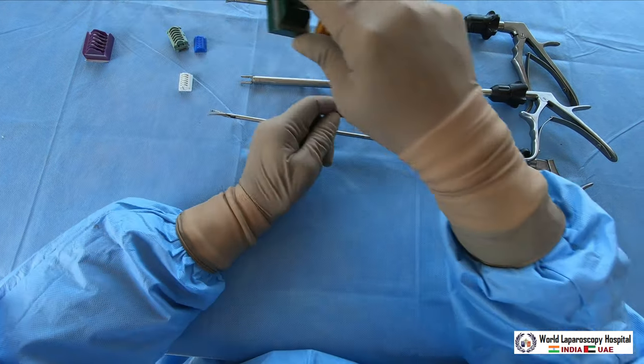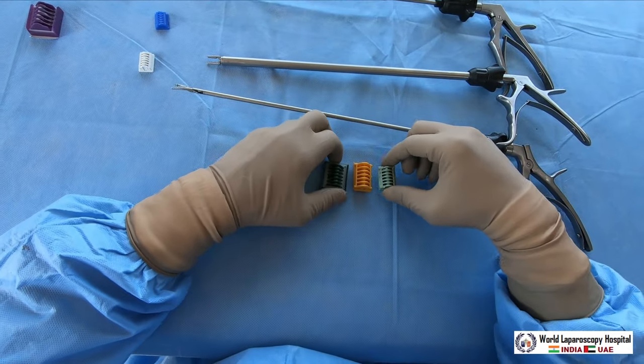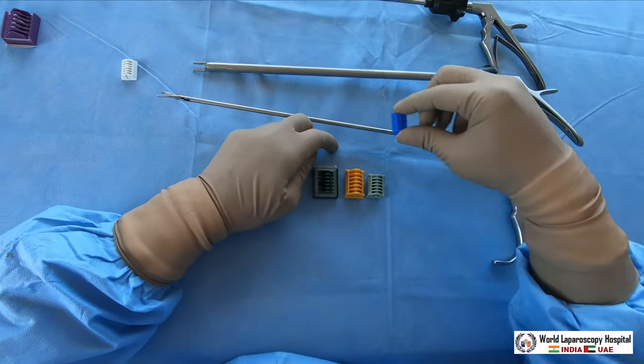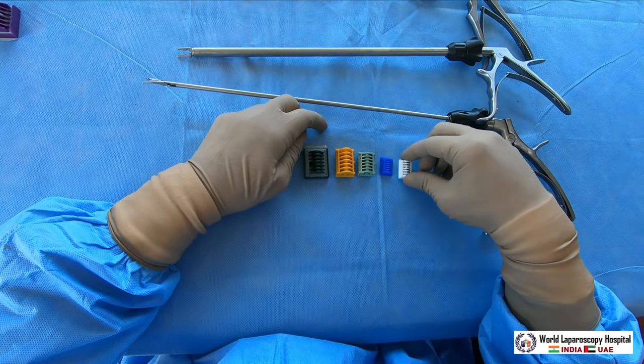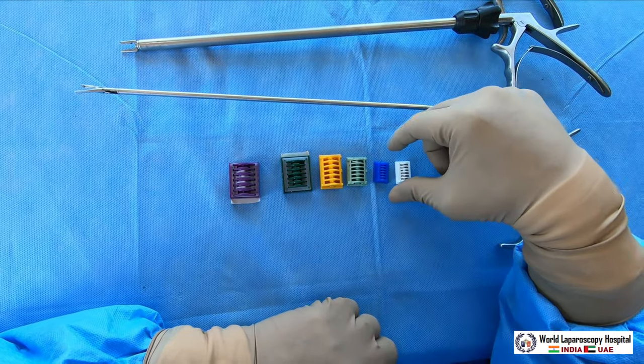You have different sizes of clips available: yellow cartridge, green cartridge, blue cartridge, white cartridge, and there are also different silicone clip applicators that are used. So these are the different cartridges.